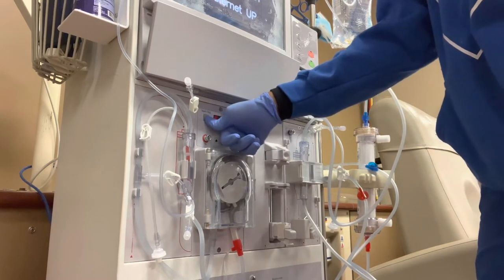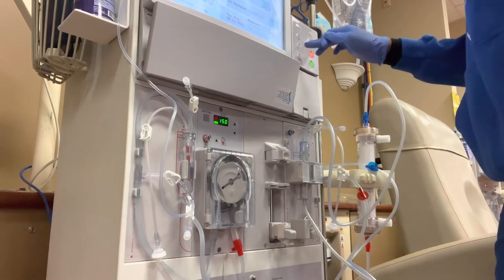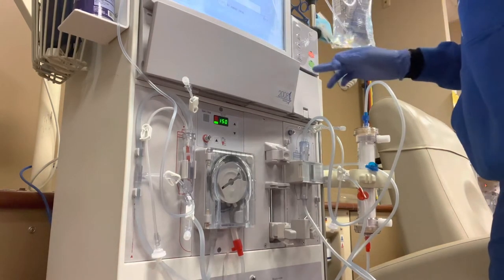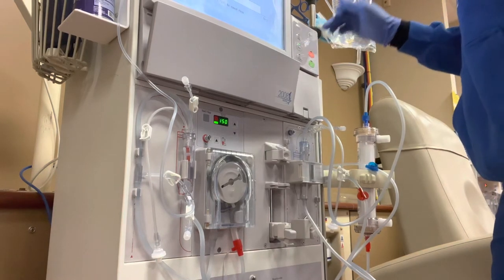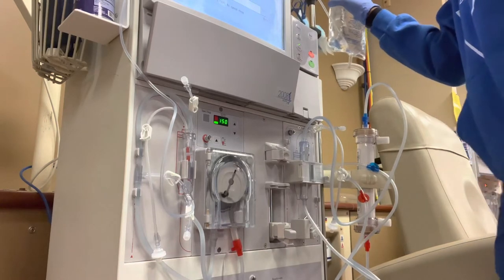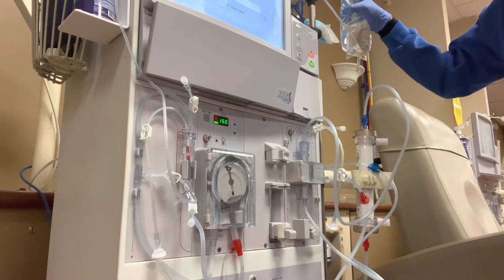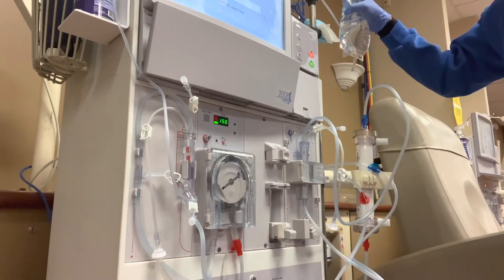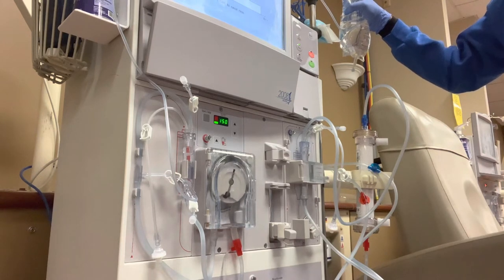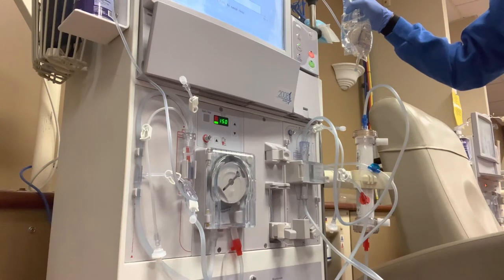So here I'm getting ready to prime. I'm setting my machine to 150, my blood pump to 150. And as y'all see, I tried to press the prime button, but it doesn't work unless it's in rinse. So boom, now my blood pump is going and I am assisting the prime at the beginning just to get some more air out of my lines, because air is a beast to get out, especially if you already got blood that doesn't touch the dialyzer. So you just want to make sure you get all the air out. So I just squeeze it a little bit while it's priming my venous chamber.